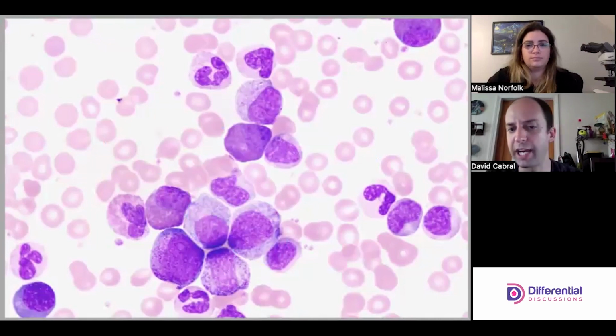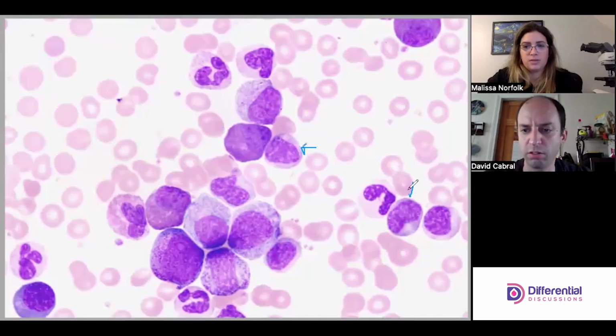Okay, and then to the right of that, we'd probably go meta. What do you think? Yeah, I think this one's a nice looking meta. That one's awesome. Classic meta. Good job, you.